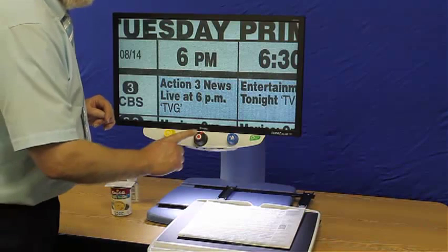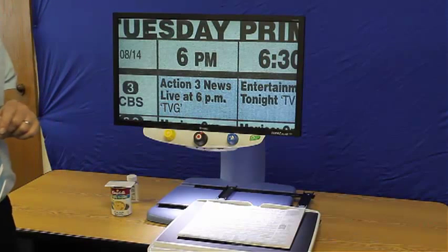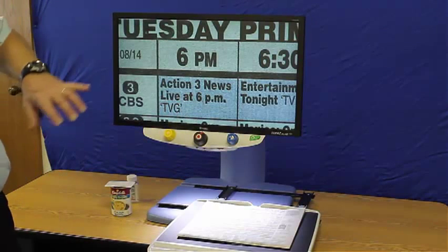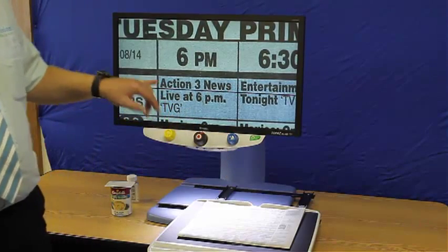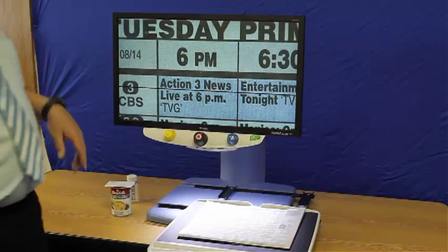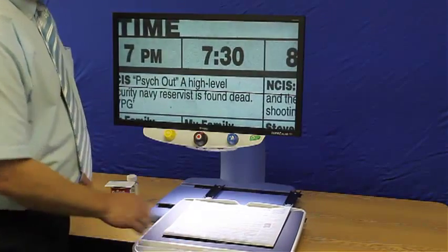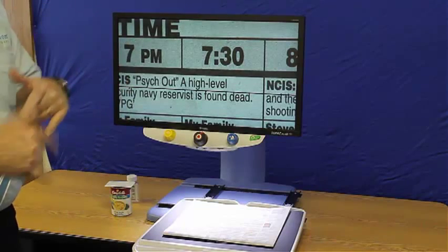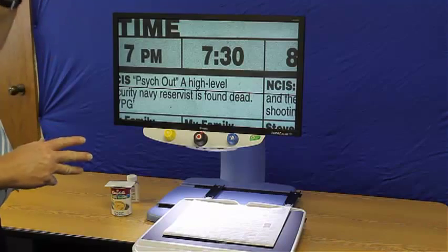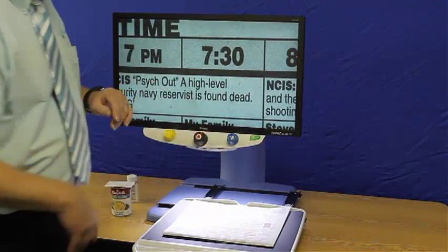Okay, then we have one other button, and that's in the blue knob. When we don't have it connected to a computer, it gives us a single line so that as we're reading across, it helps us follow along. Or if we have a bunch of numbers, we can follow along. A phone book, it could help you find the name and then the number. Push it again and it's off.